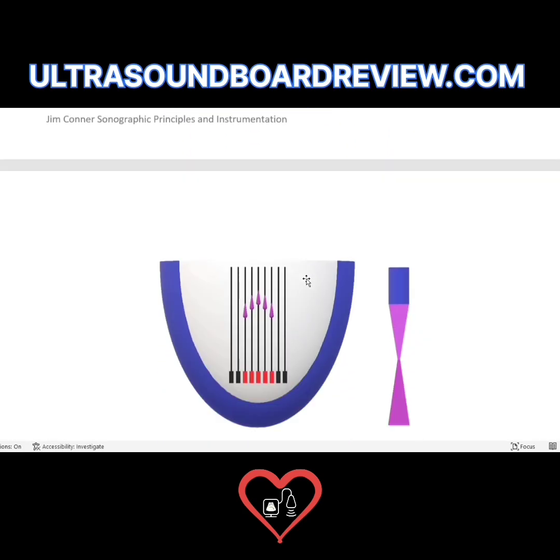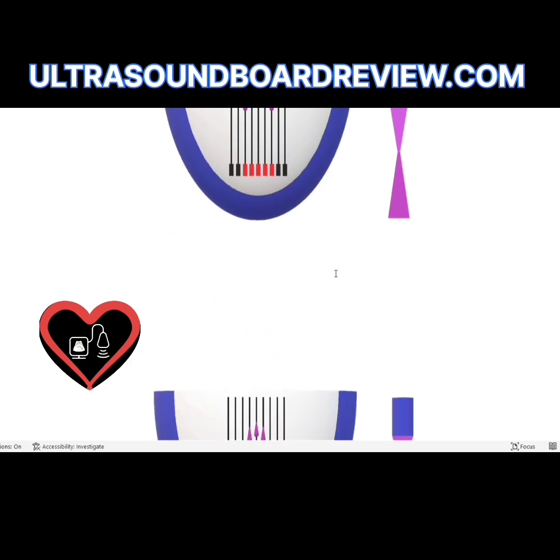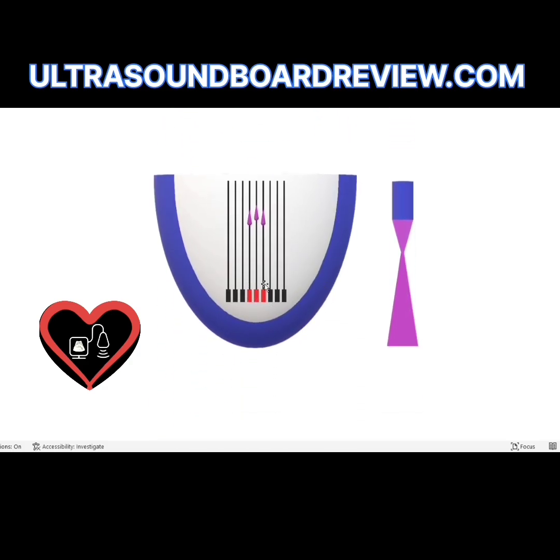Then when we go to this diagram here, the second to last crystals are shut off, thus making the crystal resemble an even smaller crystal, decreasing the focal depth and the near field zone, bringing the focal point to this area. Then when we go to this diagram here, we only have 3 crystals remaining with the outer crystals shut off, making the combined crystals resemble an even smaller crystal, thus decreasing your focal length and bringing the focus or the focal point up to this area.